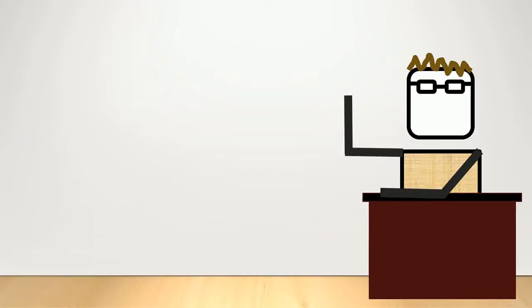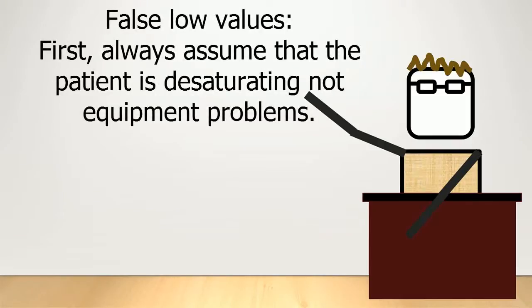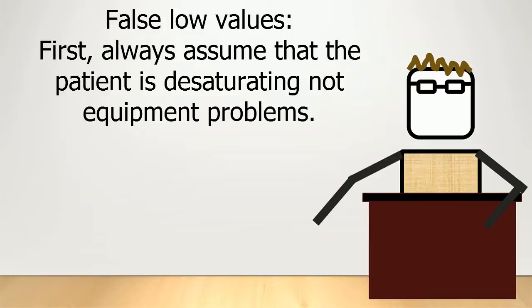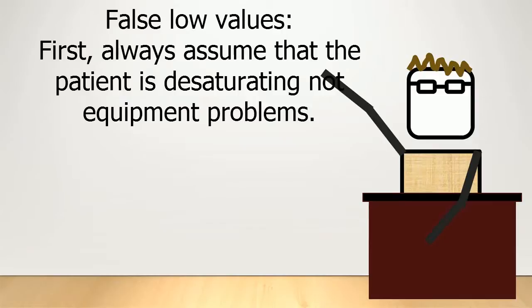There are some rare cases where there's a falsely low oxygen saturation, but for the vast majority of the times you should always assume that the desaturation is due to a patient problem and not the equipment. Also, if the probe had been accurate up until the time the desaturation event occurred, then you should assume that the problem is with the patient and not with the probe. Too many times I have seen fixation error where everybody watches the desaturating patient and plays with the sat probe instead of actually dealing with the patient who is having a problem.